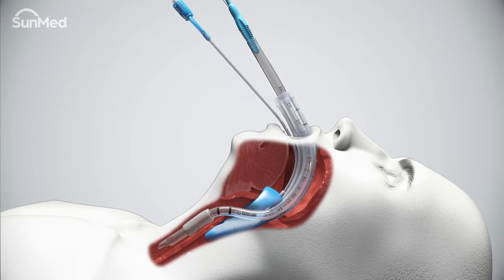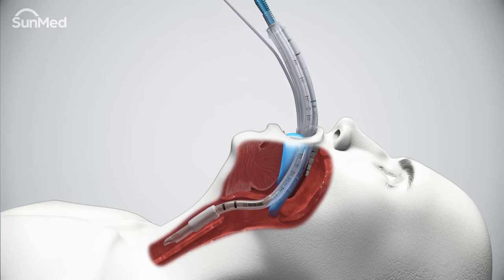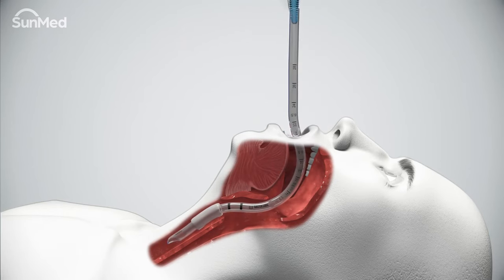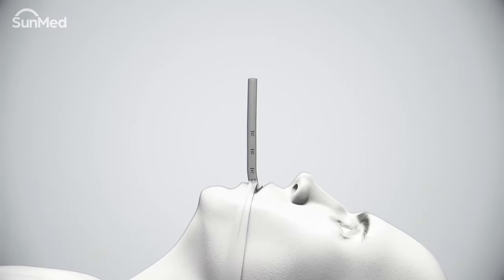While exerting inward stabilizing force on the removable stylet, slowly withdraw the air Q3 airway over the stylet rod. Reposition the endotracheal tube to the proper depth and inflate the cuff. Secure the endotracheal tube, replace the connector, and attach to an appropriate breathing device. Verify adequate ventilation.